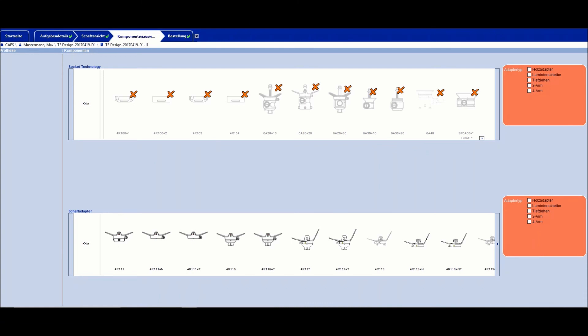The component selection tab is where socket adapters can be selected. These are not mounted. Only the vacuum forming adapters from service fabrication are integrated during the vacuum forming process.